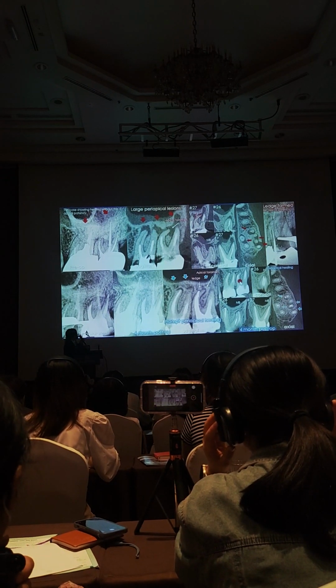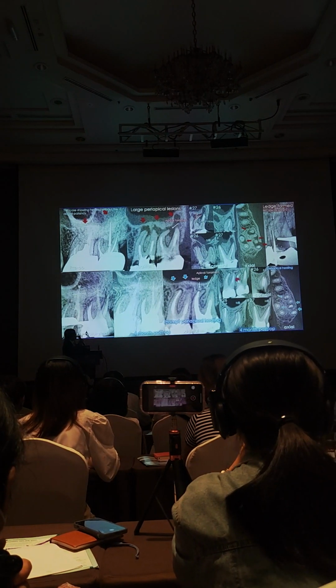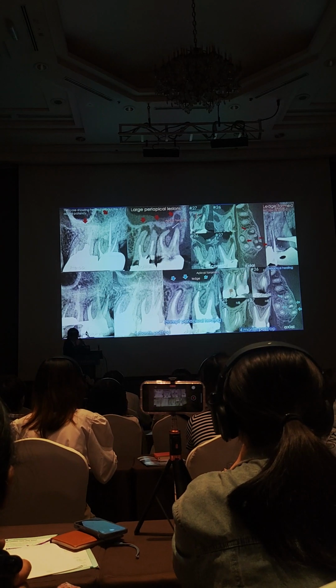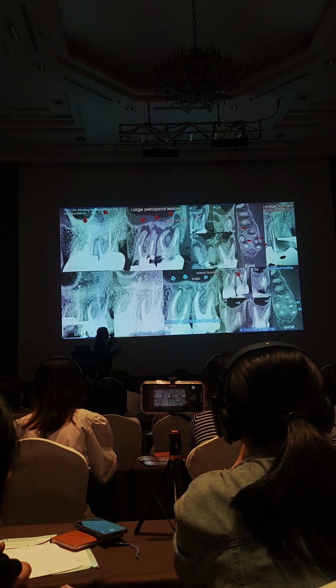You see, I was not able to reach the apical one-third here. So I had no choice but to obturate the canal only in the middle one-third. However, you see the healing. You see the lamina dura completely reformed on the root. No more periapical disease on this root.